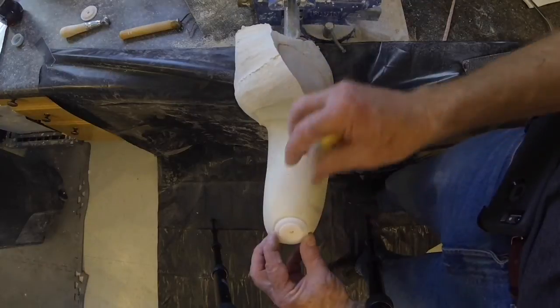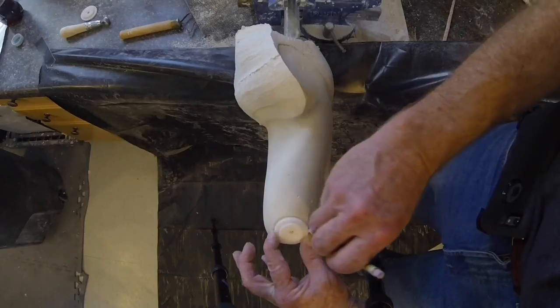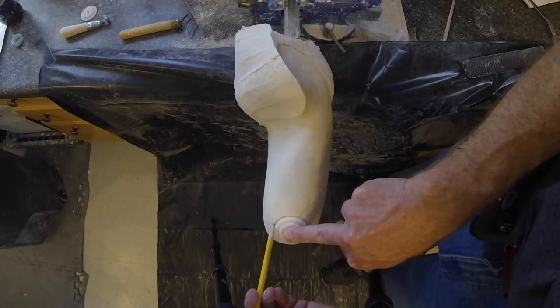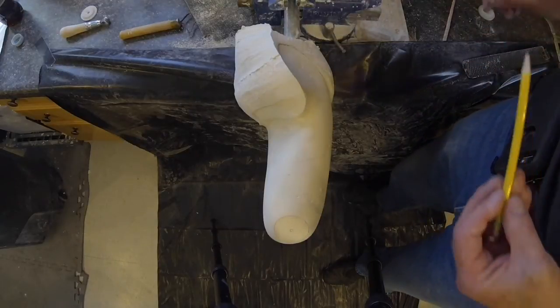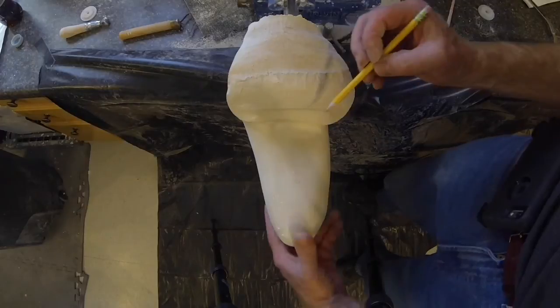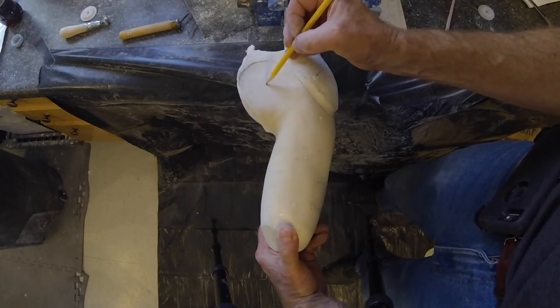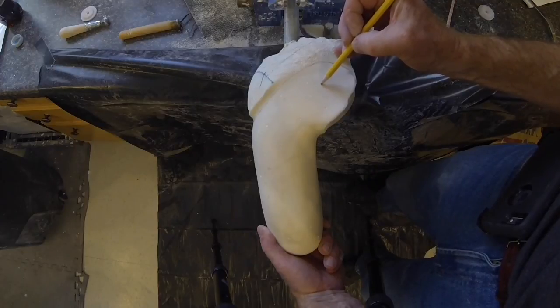Mark the exact valve location. For custom rolled silicone sockets, identify the exact mounting anchor locations. The plaster model is now ready for test socket fabrication.